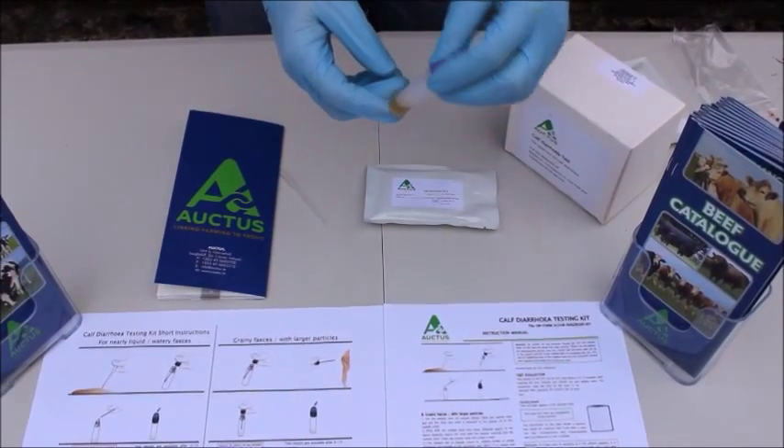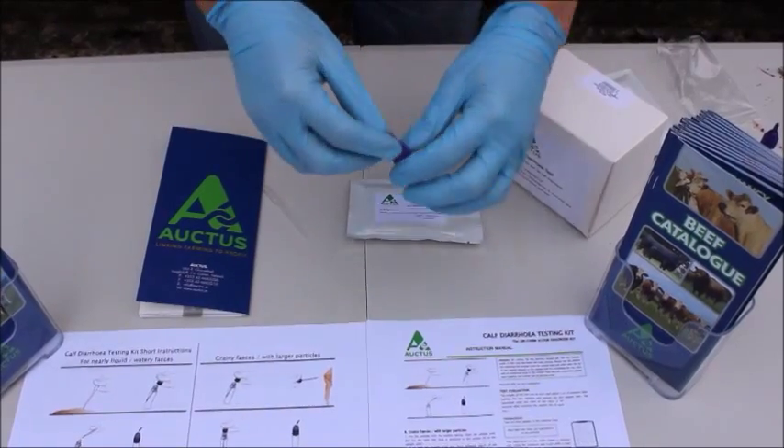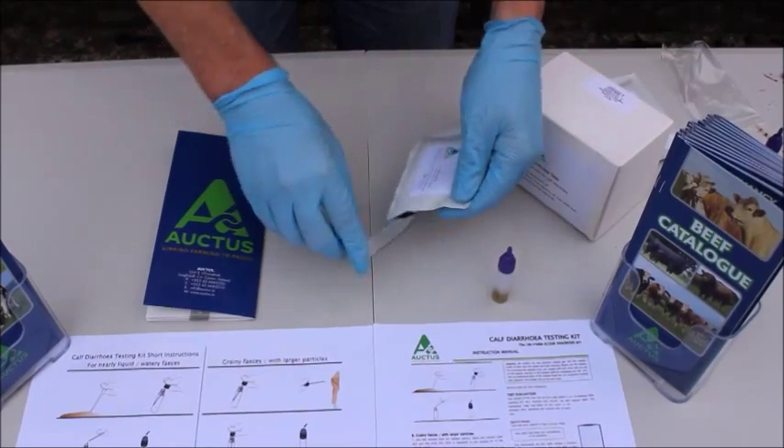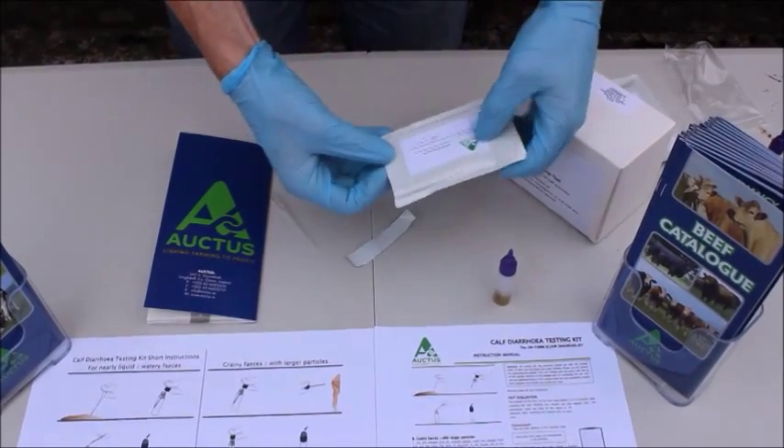Once the colour is a brown or yellow, we're ready to use the sample. We then open the sealed pouch, which is sealed until we're ready to test the solution.